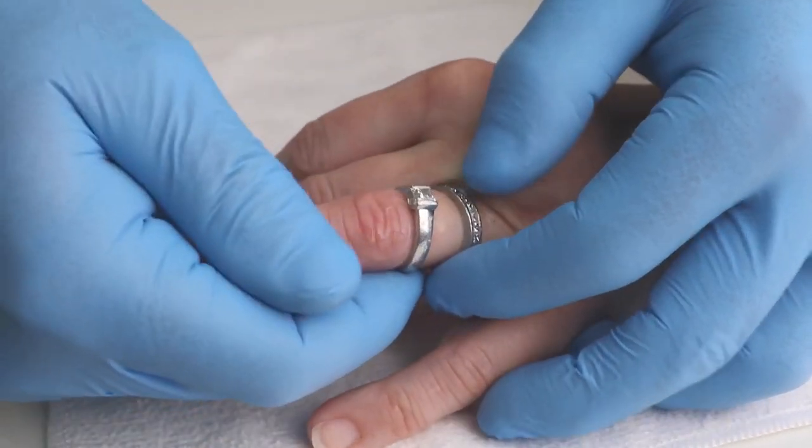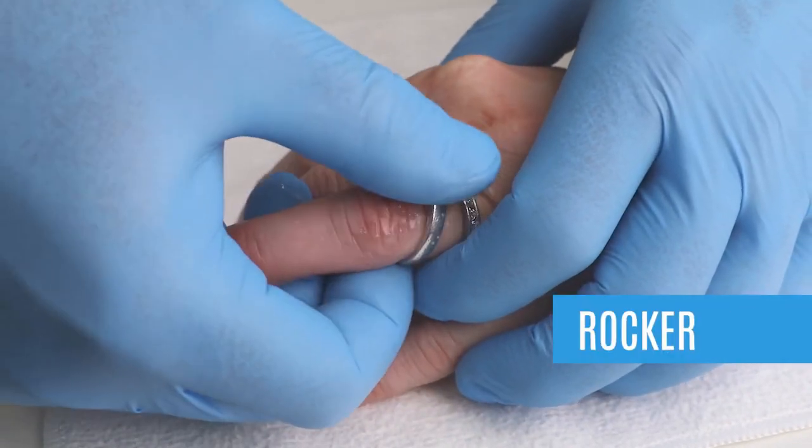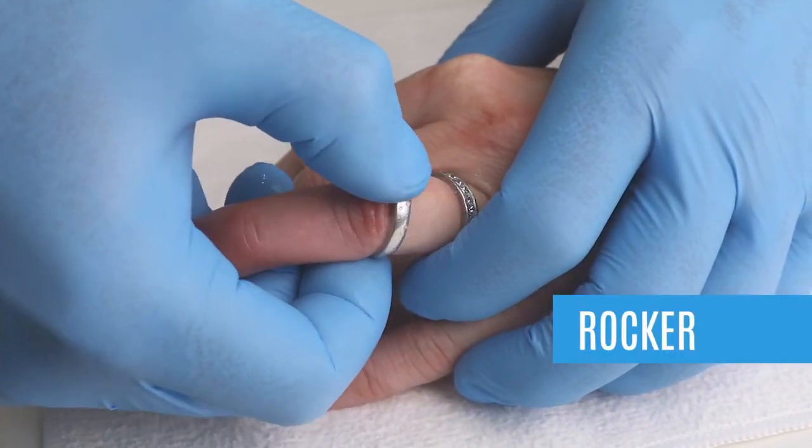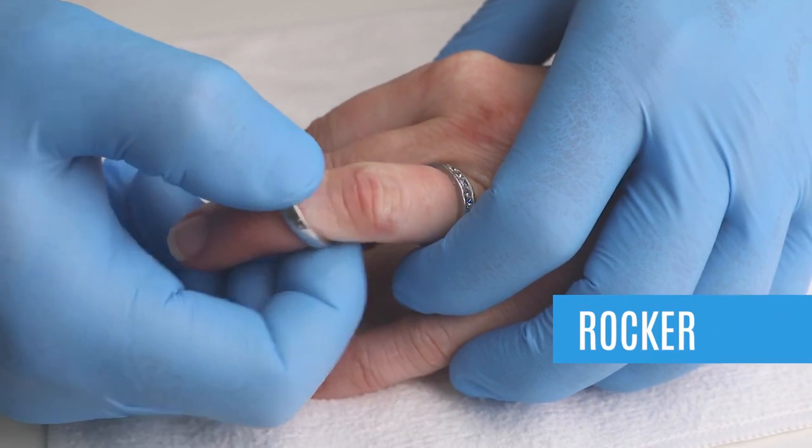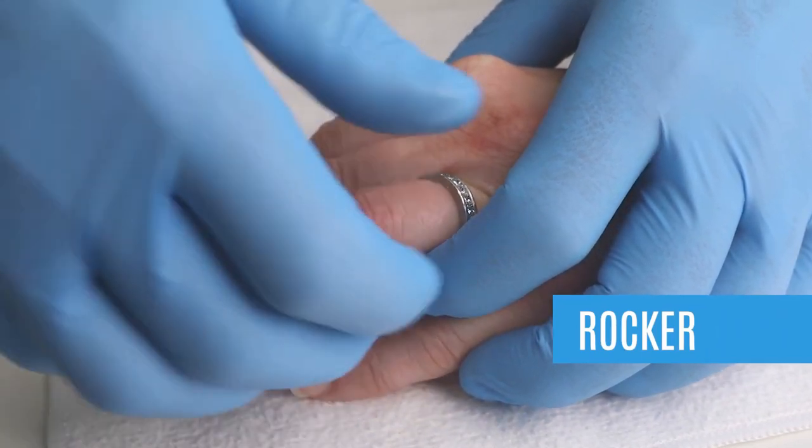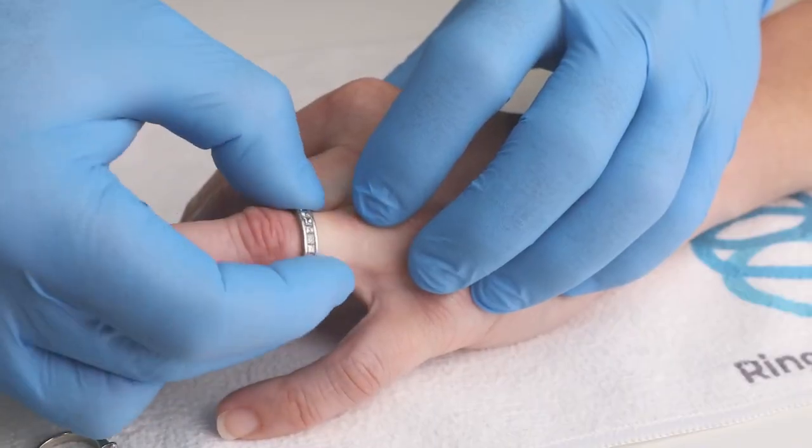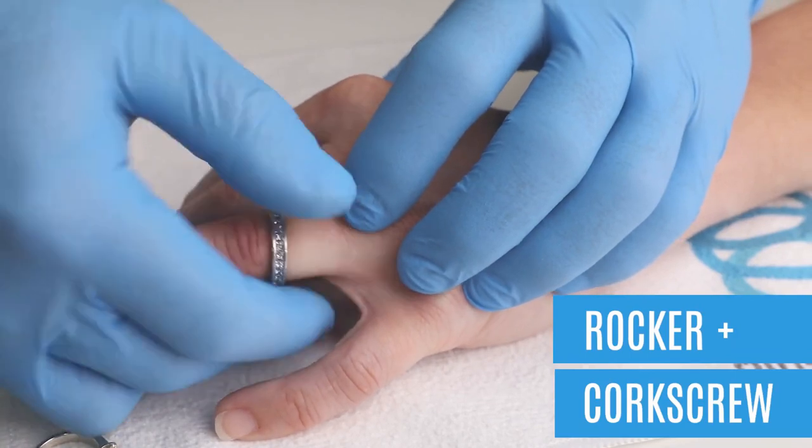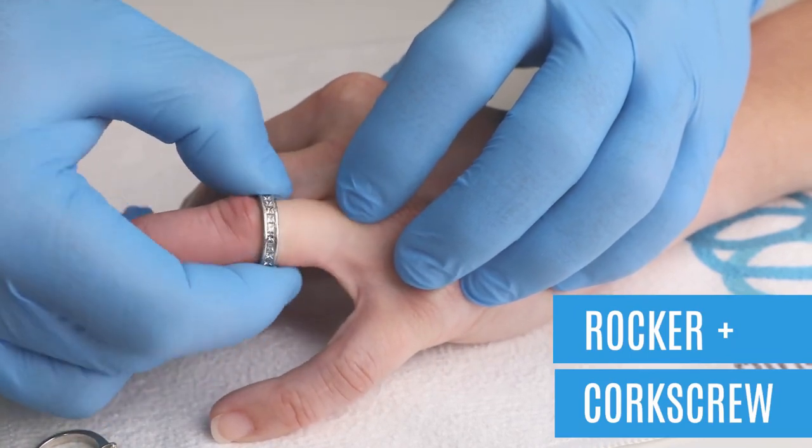If meeting resistance from the tissue, you can attempt what we call the rocker technique, which is walking the ring off the finger in a back-and-forth motion. But remember, slow and steady. If still meeting resistance, use the rocker with the corkscrew motion as they can work together to get the skin underneath the ring.